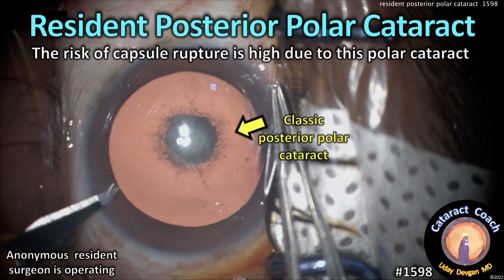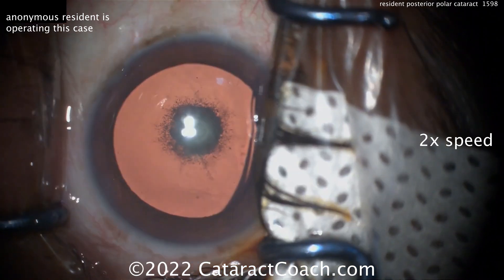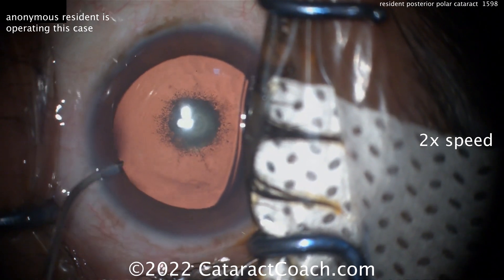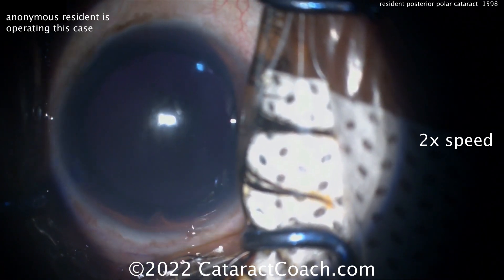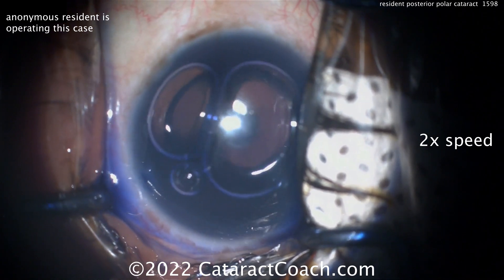CataractCoach.com — resident posterior polar cataract. The risk of capsular rupture is high due to the posterior polar cataract. An anonymous resident is operating here, and you can see that's a classic posterior polar. Look at that demarcation between the opacity centrally and the clear area right next to it. There's no fluffing out or feathering of it. Definitely not a posterior subcapsular cataract — it's posterior polar.